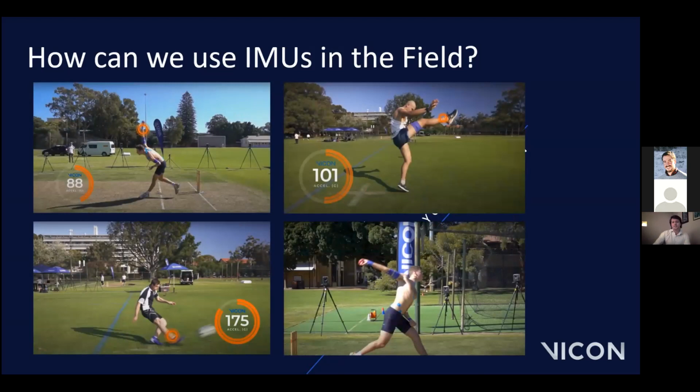So there we saw how the sensors attached to the athletes measured the segment accelerations. This can be used as a measure of performance or even monitor an athlete's return to play. And we also heard how current research studies are investigating the use of IMUs in illegal action testing in cricket and injury prevention for junior bowlers by measuring shoulder and trunk counter-rotation.